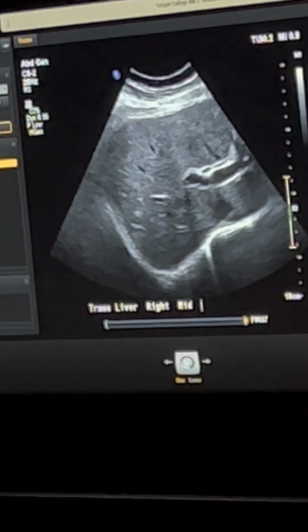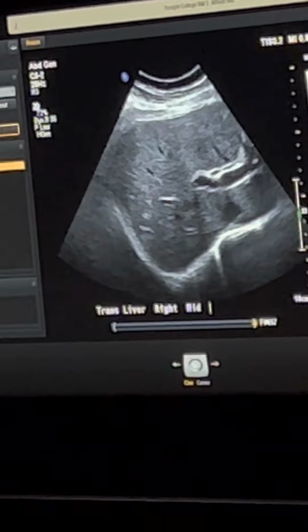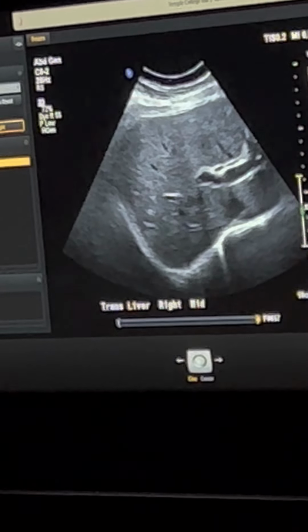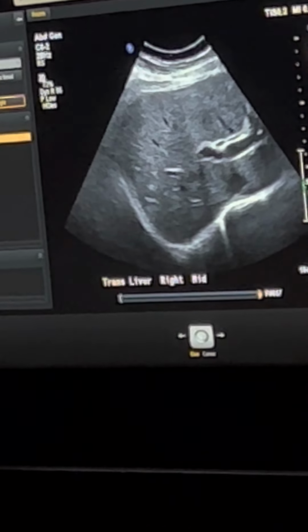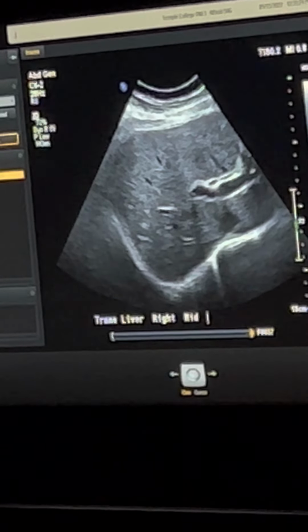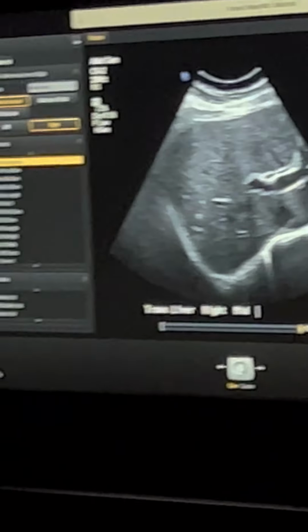But we do want you to show the hepatic veins in a picture too. That's why I was asking if that was on there or not. So I want to see hepatics. What is that? Separate picture. Okay. Maybe I missed it. I don't know. Liz is arguing that the hepatics are supposed to be superior, not mid or something. Yeah. I mean, I don't necessarily agree with that.